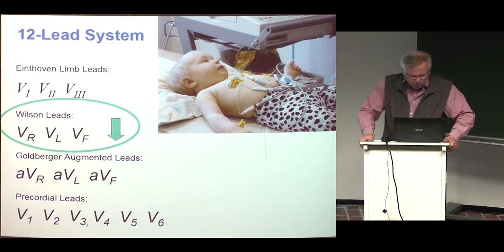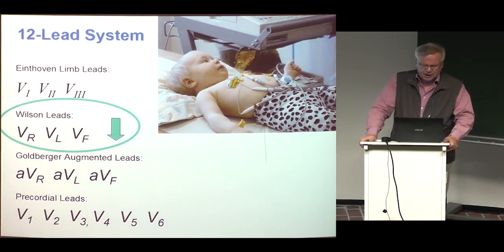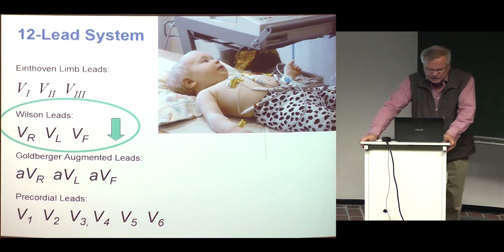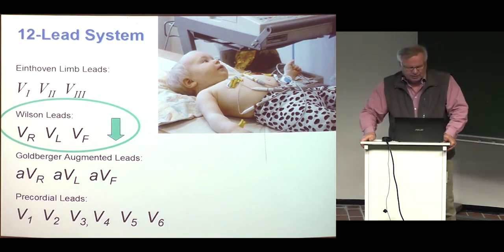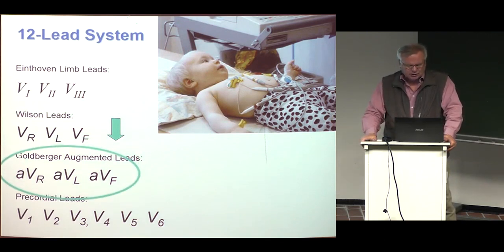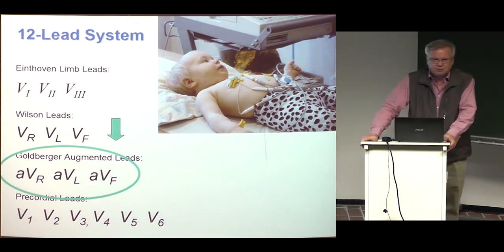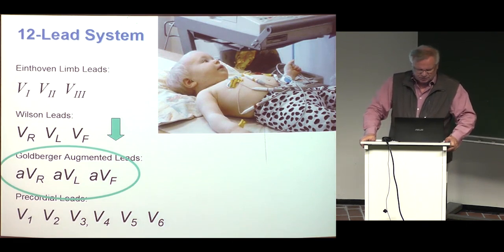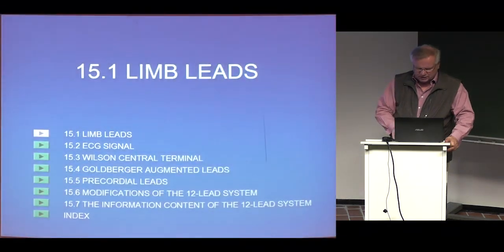It is composed of the three Einthoven limb leads, I, II, and III. It has Wilson leads VR, VL, VF, but they are augmented and called Goldberger augmented leads, aVR, aVL, and aVF. I will tell in detail soon what they are. And then the precordial leads on the surface of the chest, V1 to V6. I start with the limb leads.